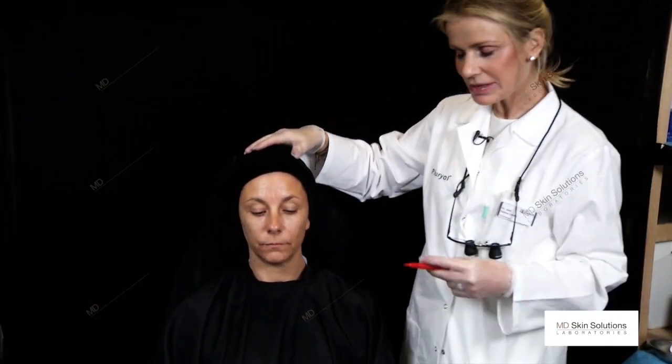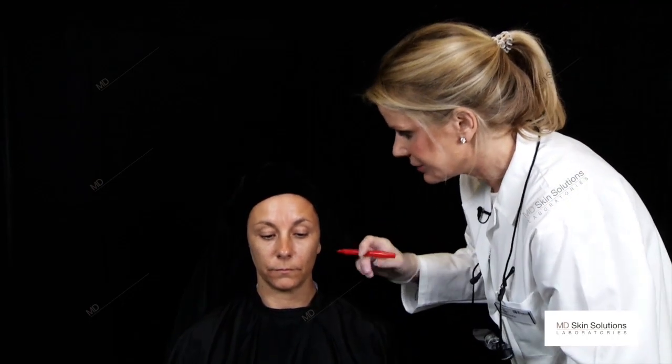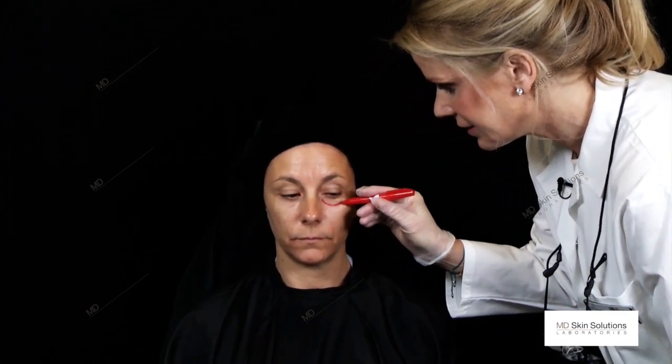To give a GPS, a kind of instruction on where to go and where not to go in a face, we will draw some mapping on her face. So the no-go area obviously is above the infraorbital rim, and we will certainly avoid the infraorbital foramen.